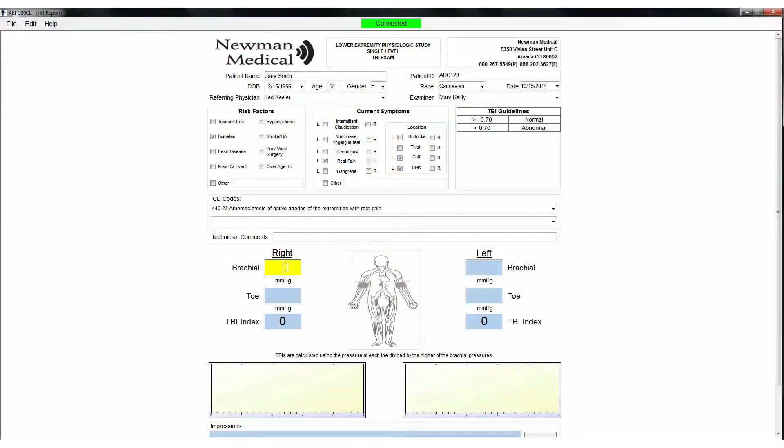Fill in patient information, current symptoms, risk factors, ICD codes, etc. on the report.